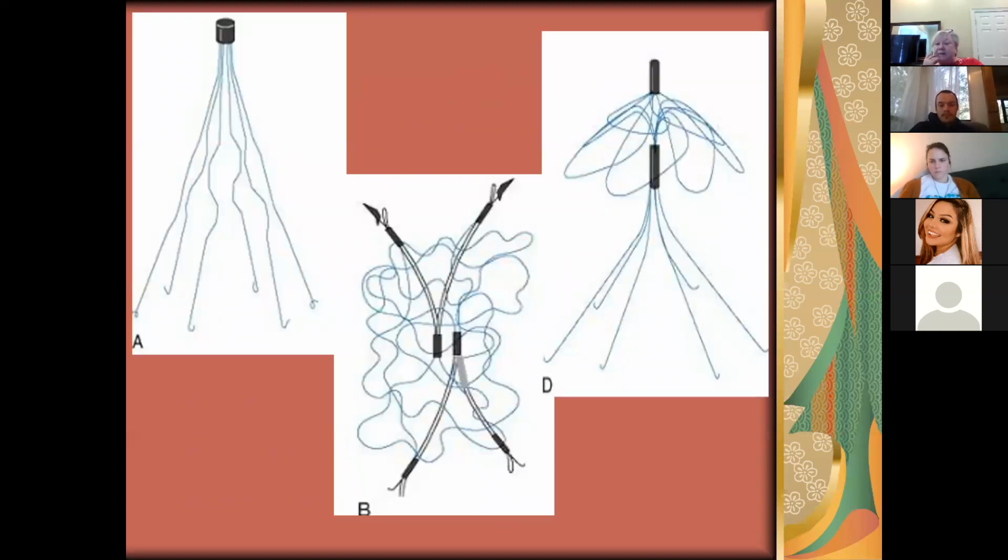These are some pictures of some of them. And if that clot breaks loose from their leg or their arm, it's going to catch that clot as it goes through their vena cava and will prevent it from getting stuck in their pulmonary artery. We typically just use these on people that have some type of bleeding disorder that cannot take anticoagulants. Which one? Depends on which one your hospital buys.